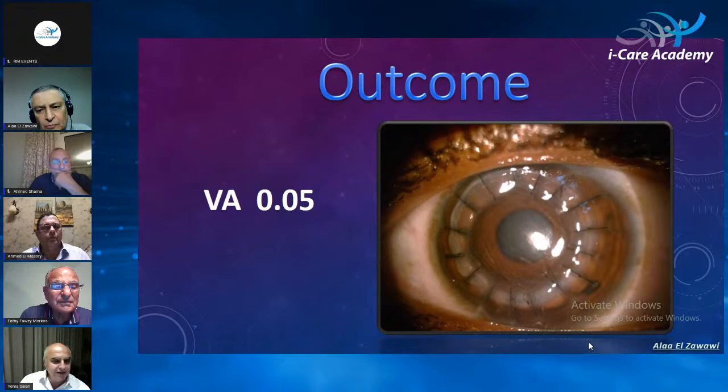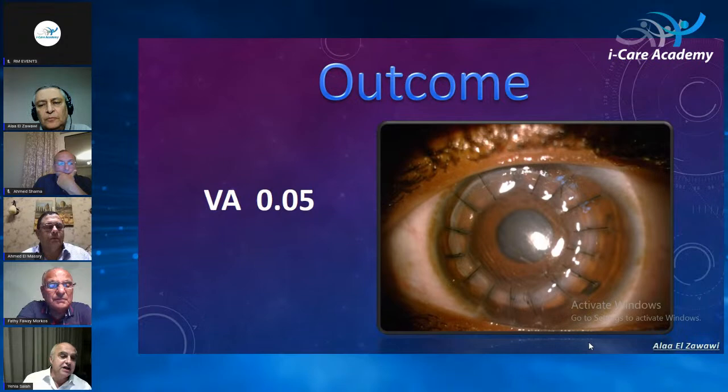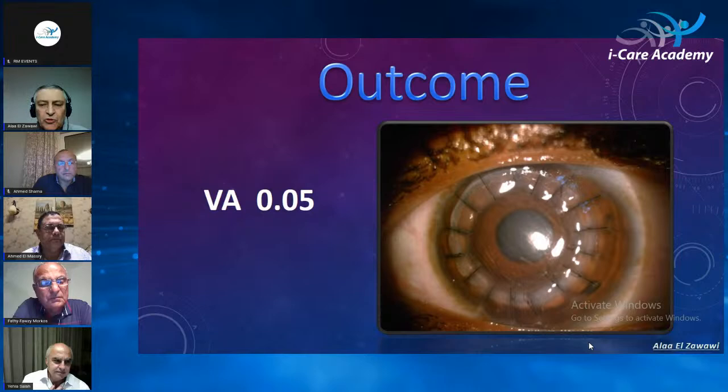But in this case, he already had the problem of a whole thickness opacification, and it was endothelial rejection. So it might not be that easy to have a good visualization, even if it's thin. But to answer your question, I don't have experience with temporary keratoprosthesis in such cases. Yes, because it is an option. Temporary keratoprosthesis and then doing vitrectomy, they are doing with the posterior segment surgeon. Yes, they do. Maybe it's an option because, of course, open sky cataract surgery is a help.